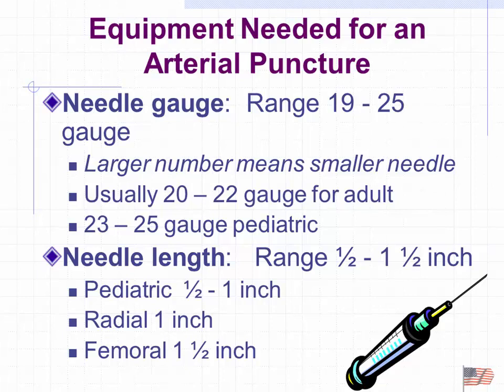Usually, we use a 20 to 22 gauge for adults, and in most kits that we'll end up finding, Amber was sick today, so she wasn't here to pass out the kits, but we'll get you guys each a kit to practice with, as well as to learn how to put together in a safe fashion. But they come with both a 20 and a 22, so you have both of them available there.